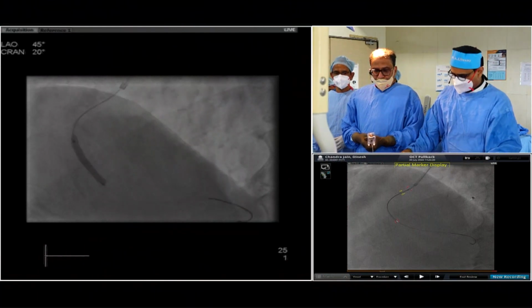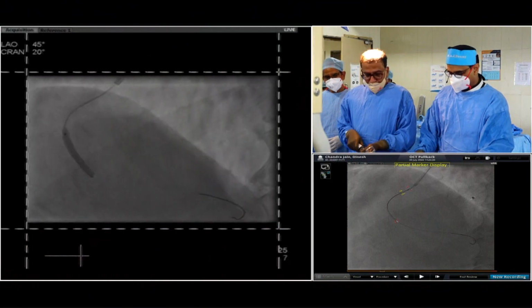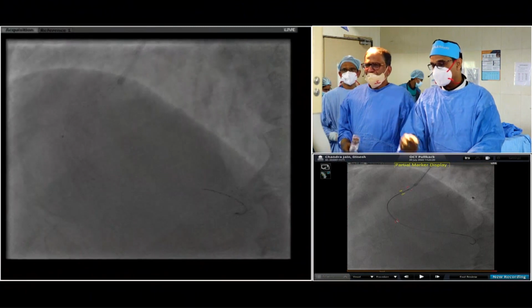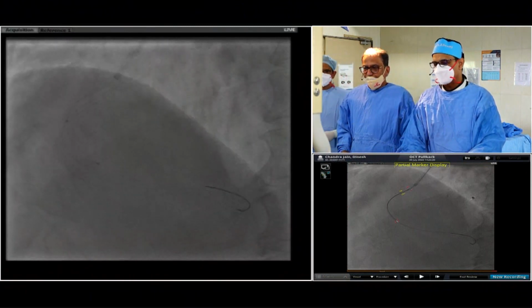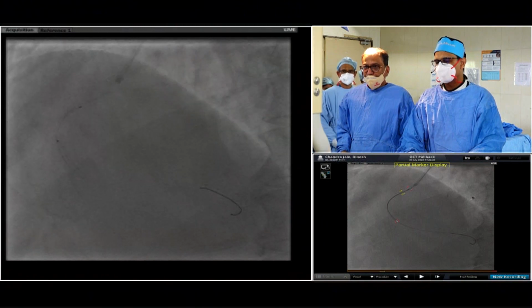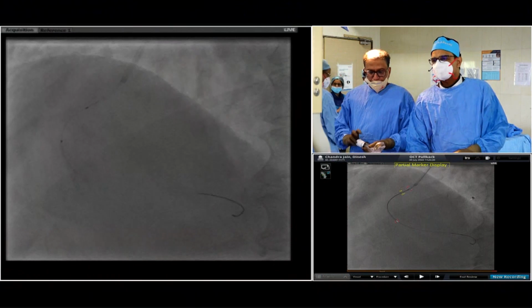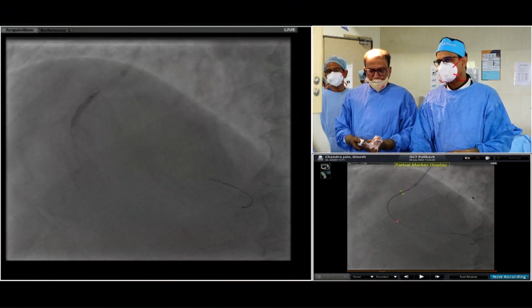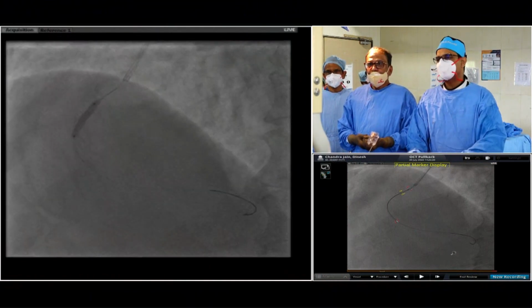Right, so in an ideal world, we would have a very nice, conveniently located side branch with which we could land it. But if you see the small screen on the right-hand lower corner, that is the landing zone which I have chosen. Let's go up here to about 8 atmospheres. I've got a little longer landing zone, so I have about 8 millimeters to play around.